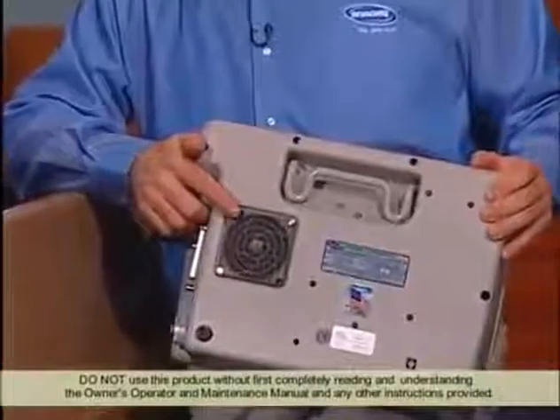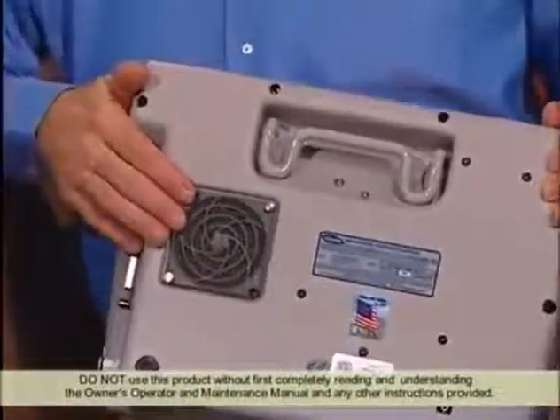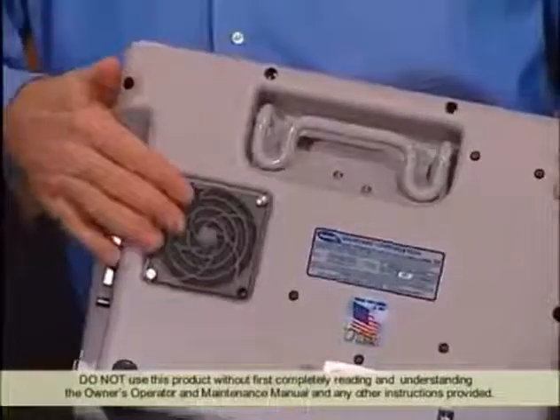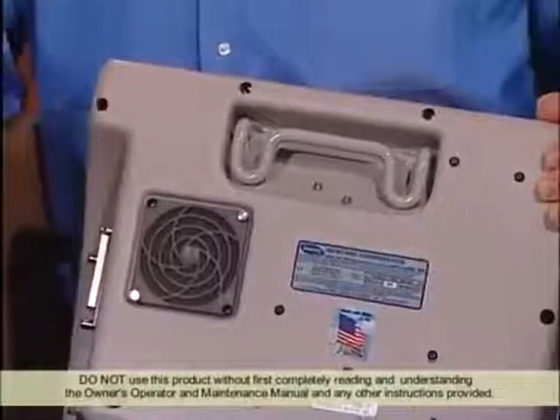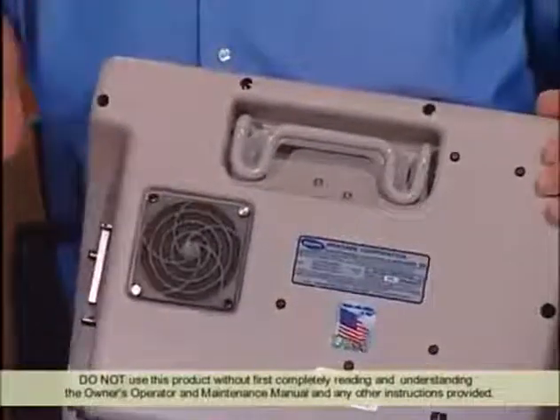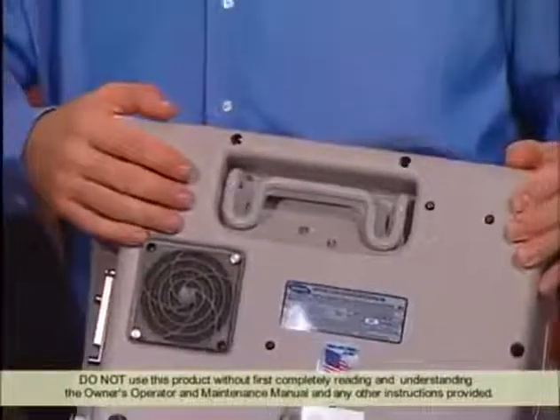Consequently, it has to be cleaned periodically. There's a sponge filter in here behind the protective cover that you take off. Clean it under some running water, let it air dry, and put it back on. And you're ready to go. But you do want to make sure that you periodically clean it.